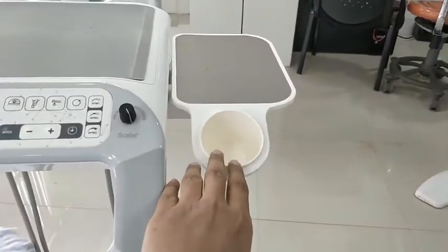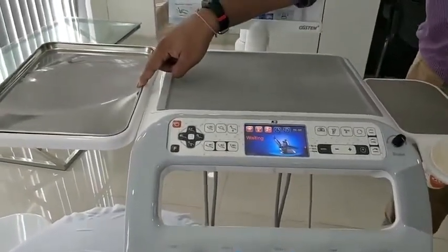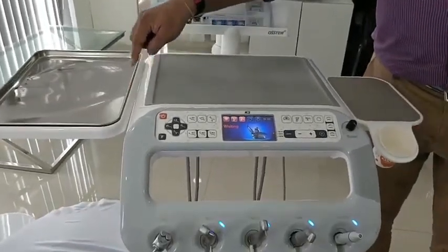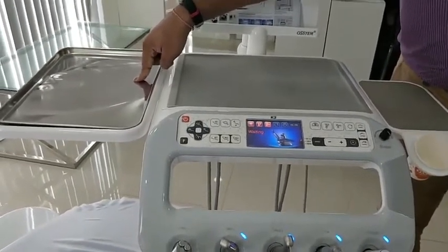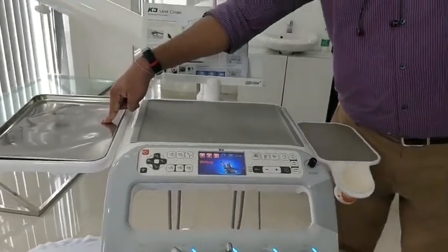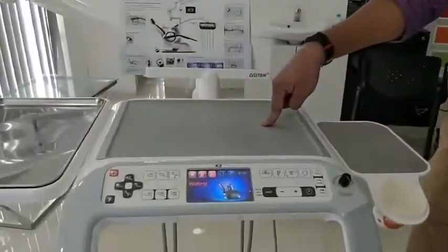If you look at the doctor's tray, this is a stainless steel tray which can be easily autoclaved for implant and surgical procedures, or any procedures involving extensive surgical instruments such as flap surgery or implant surgery.